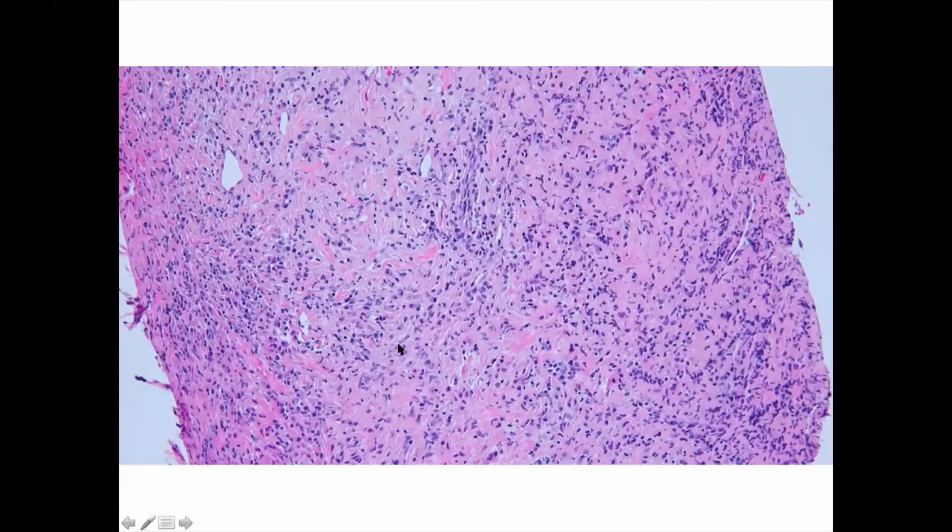It will be plasma lymphocytic, predominantly plasma cells, and there's lots of fibrosis in between, or it will have a storiform pattern with a cartwheel appearance, where some of them are just radiating, like a storiform pattern, like a cartwheel. And you will be thinking serum IgG4 is increased.